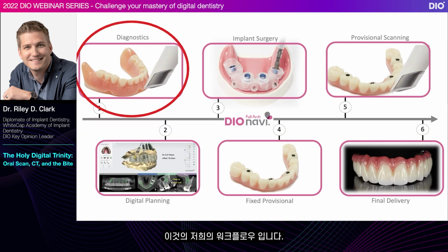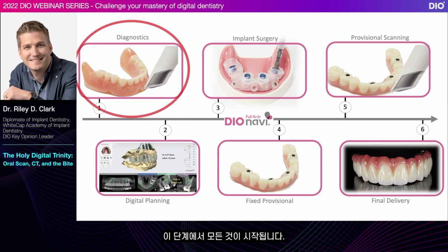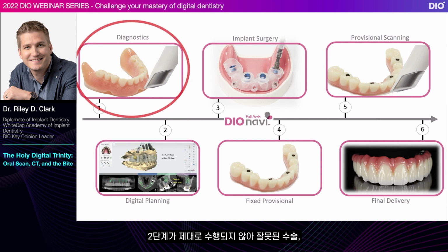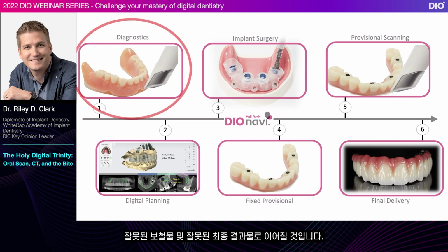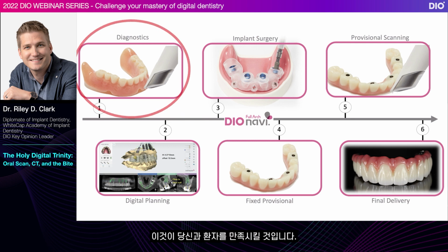So this is again our workflow. If you watched my webinar last week, you saw me show this workflow, step 1 through 6. Each of these steps is obviously an important part of the workflow, but step 1, the diagnostic step, is obviously where the tire meets the road. That is where everything gets started. If these 3 data sets are not obtained in an accurate, proper way, then step 2 will not be done properly, which will lead to bad surgery, bad prosthetics, and a bad final product. Really, what we're talking about is the foundation of thoughtful, predictable workflows that leave you and the patient happy and satisfied.